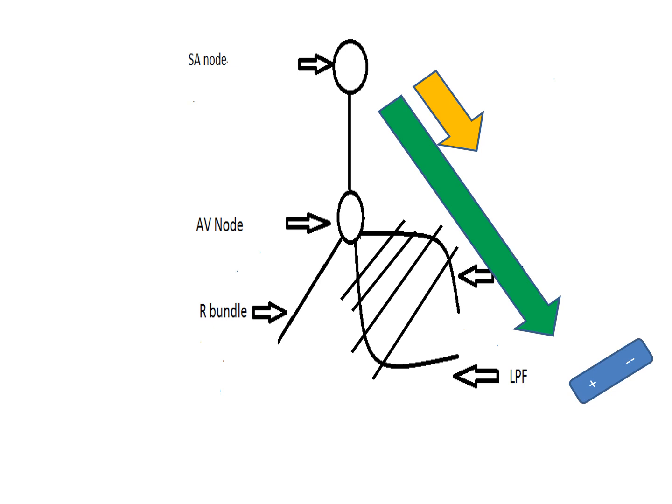Now, in a left bundle, that relationship has broken down. Because the fascicles have been blocked, it's taking a very long time to reach the bottom of the heart. In fact, longer than the refractory period of the myocytes. So as the bottom of the heart is depolarizing, the top starts to repolarize. So now we have depolarization and repolarization going in the same direction, but they're of the opposite electrical signs.